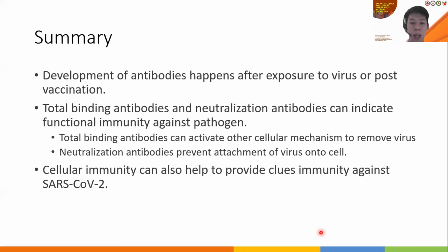In the event whereby no antibody is detected, we also recommend looking at the cellular immunity arm of the patient, where using cellular immunity can help provide clues as to whether the patient has immunity against the SARS-CoV-2 virus at all.